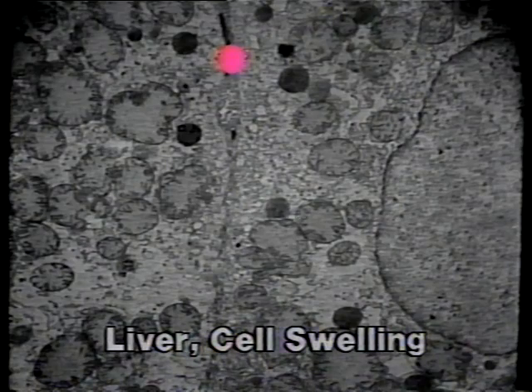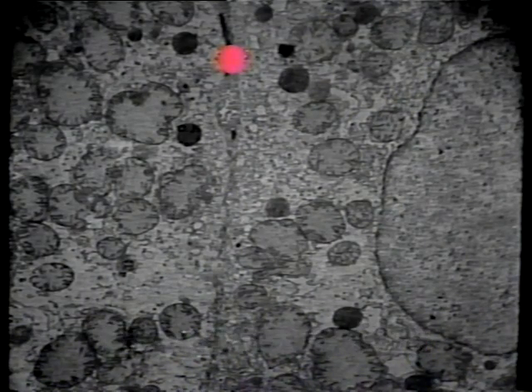Now you see an electron micrograph of rat liver that had been experimentally injured by acute poisoning with methyl mercury. This preparation was made 4 hours after exposure to the poison. Cellular edema is detectable. This vertical line represents the border between two hepatocytes. And here is a bile canaliculus lying between the liver cells. Over here is the nucleus of one of the cells.